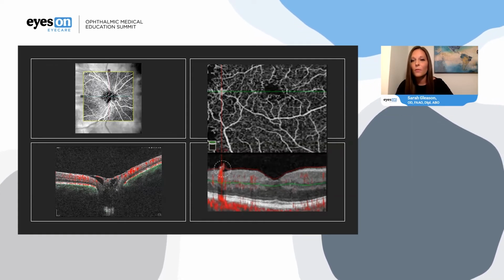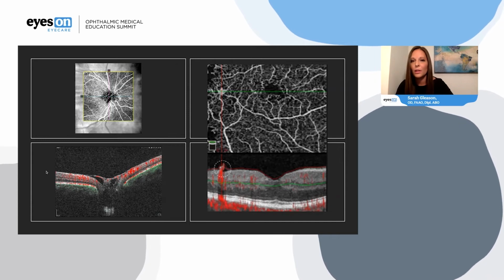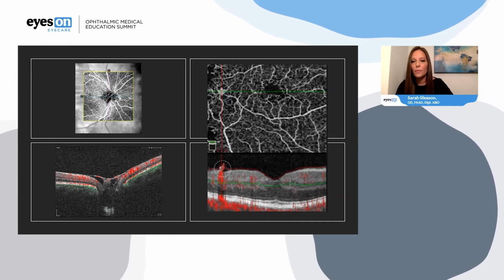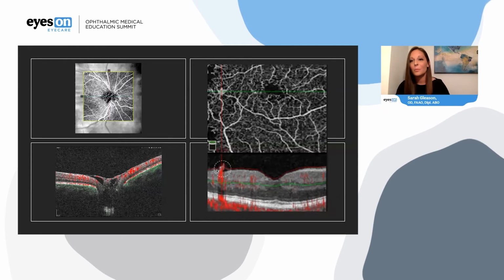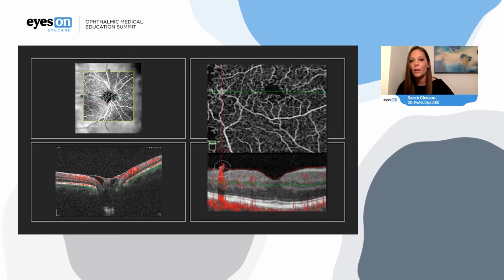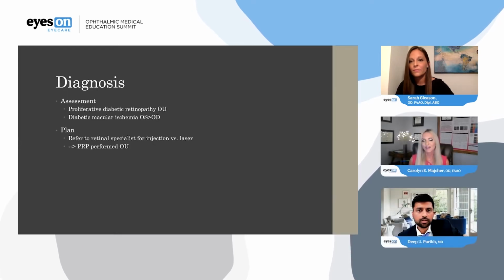In this patient, unfortunately, the OCTA did not capture that area of retinal neovascularization, but I did pull an image just to show you what that would look like. So this is showing an area of retinal neovascularization. And as was just said, we know that this blood vessel should not be growing on top of the retina, so you don't even need OCTA to say that there's blood flow in the area. If you see a vessel that looks anomalous and you do an OCT through the area, you can really document that neovascularization quite well. Dr. Parikh, I'm curious to have your input on that.